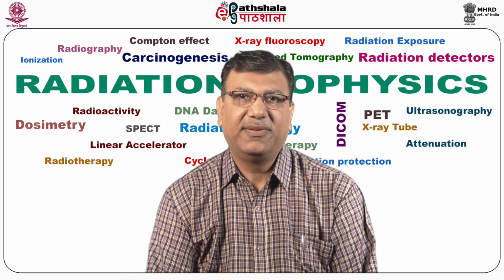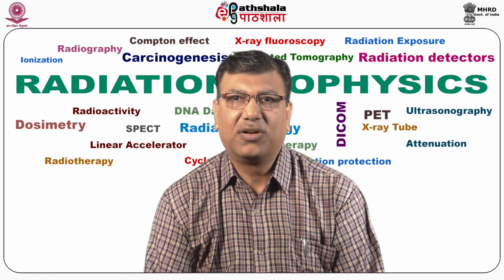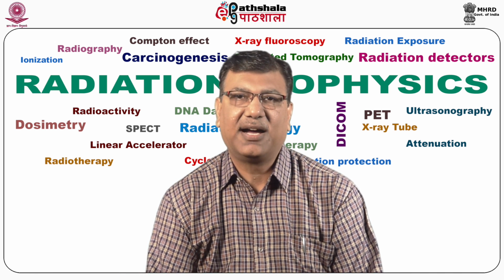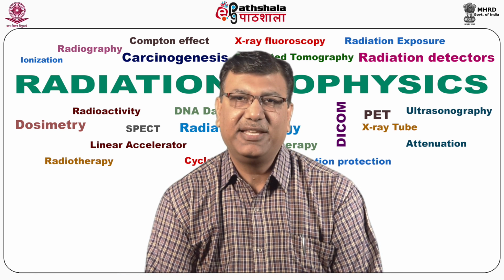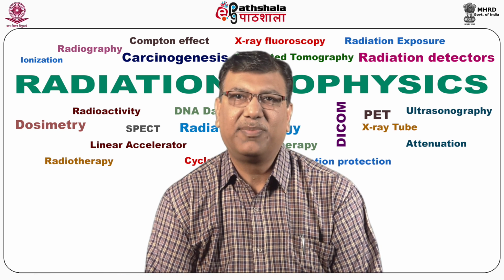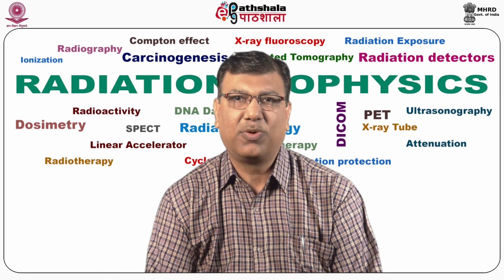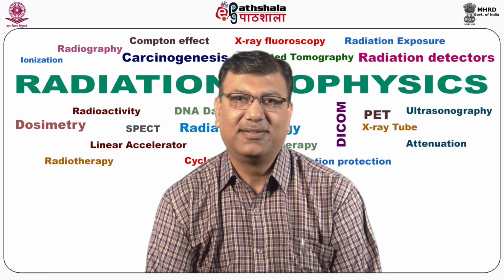Endovascular brachytherapy is for the management of obstruction or blockage in the blood carrying arteries. The modes are bypass surgery and PTCA with stent. The drawback of bypass surgery is patient trauma. More failure cases are seen.